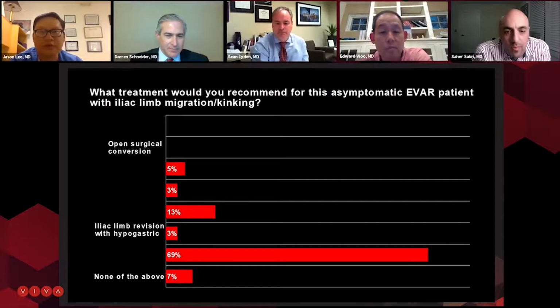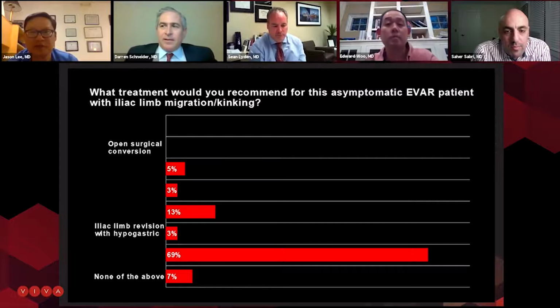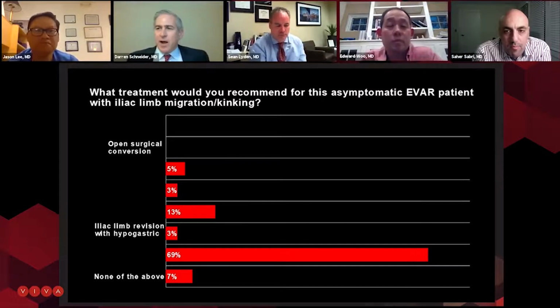So here's our first question: what to do with this patient. Hey Darren, were those 24 millimeter Zenith limbs the old style? Like, was it an old Zenith from 10 years ago, or was it spiral Z limbs that are more flexible? No, they're spiral Zs, but I think they were 24 millimeter diameter, and so that should give you some concern too, because the iliacs are now measuring 26.